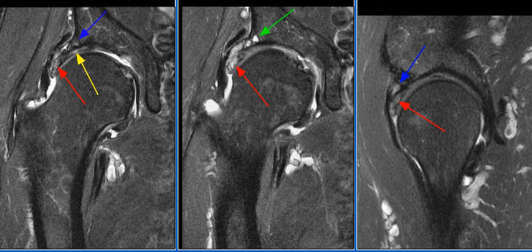These MR findings are consistent with labral hypertrophy and tear and mild developmental dysplasia of the hip.